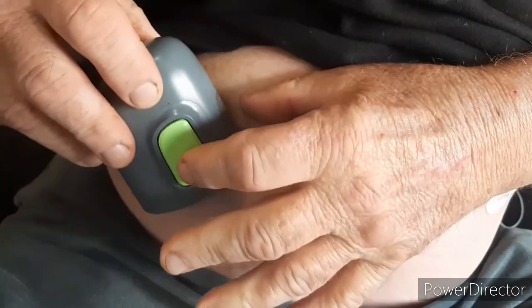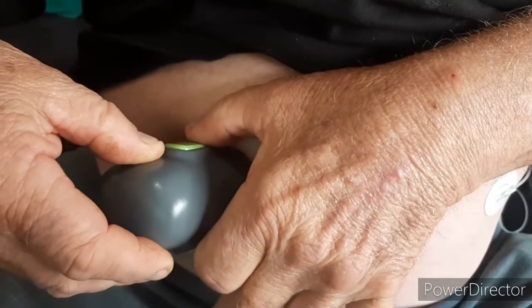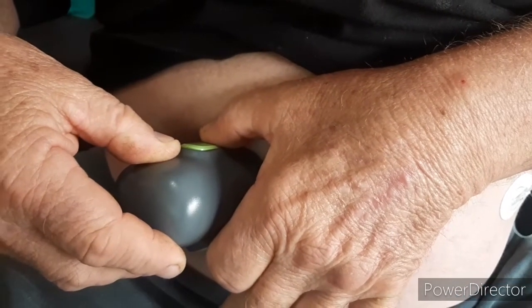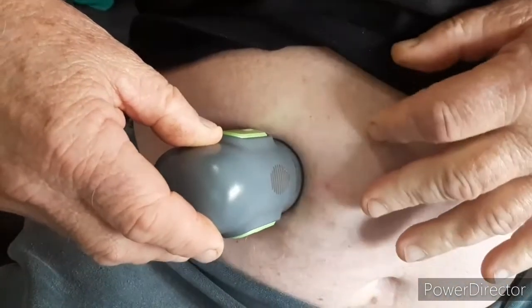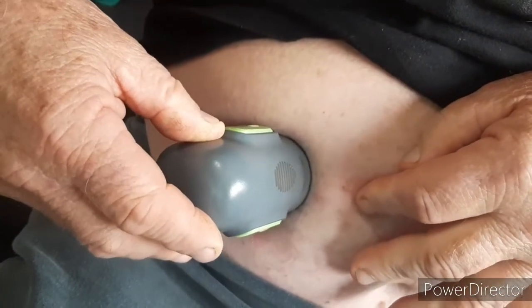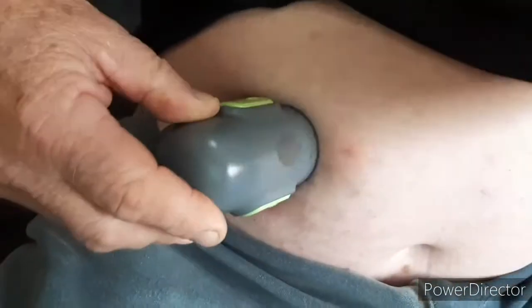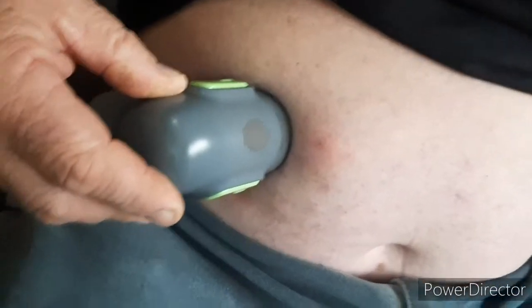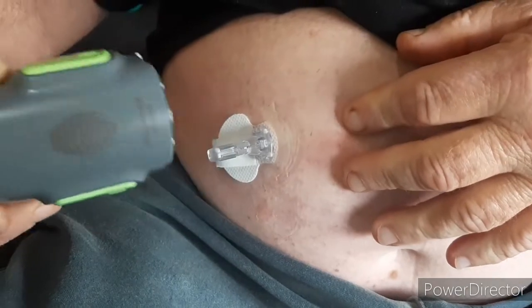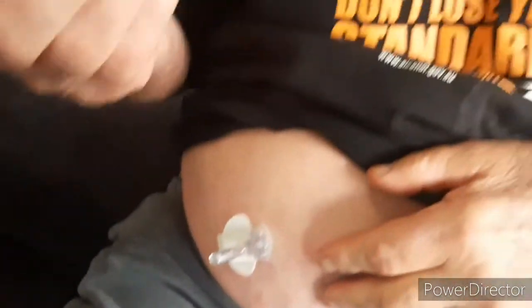Locate where the buttons are on the green pads and squeeze — one, two, three. It went down, so that's in now and sited. Leave it, count to about three or four before you remove the applicator, to make sure it's stuck properly.